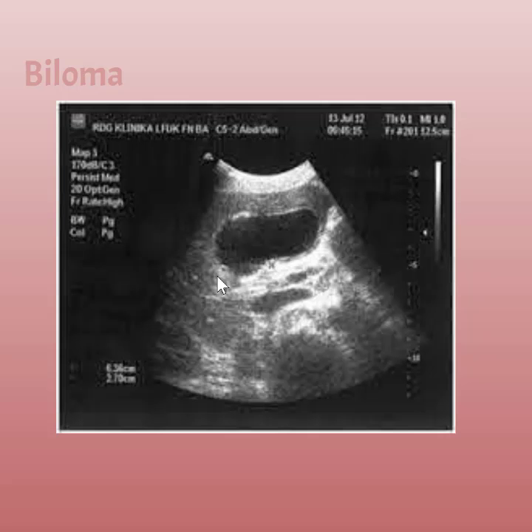So here's an example of a biloma. Again, a patient most likely has already had their gallbladder removed. You put the probe down and there's what looks like another gallbladder sitting there, and you're totally going to think that you have lost your mind, and you're going to ask the patient, are you sure you had your gallbladder removed? And they're going to go, yep, but it's going to be painful. It's not going to feel good. This is most likely a biloma.